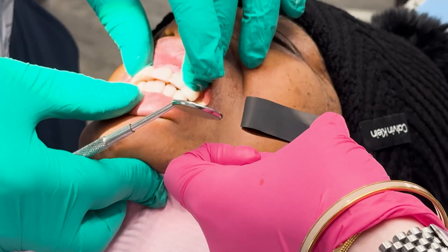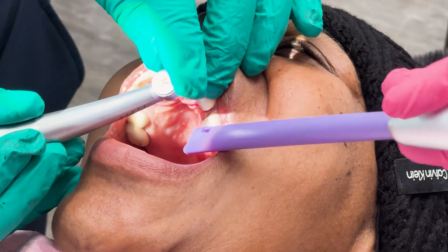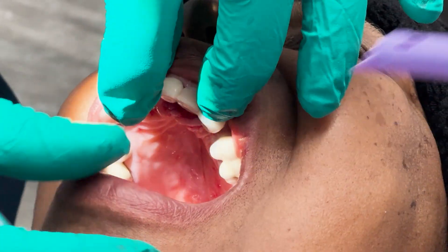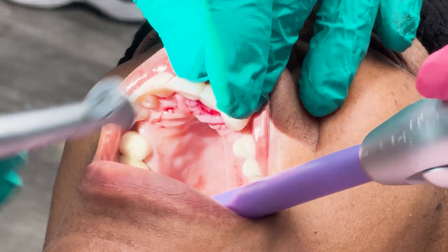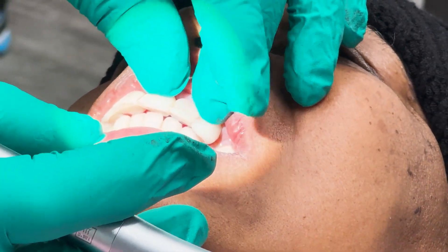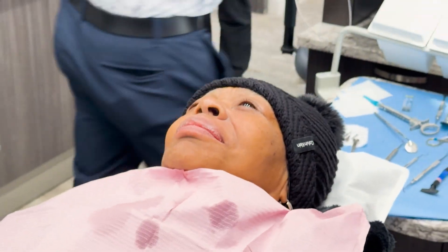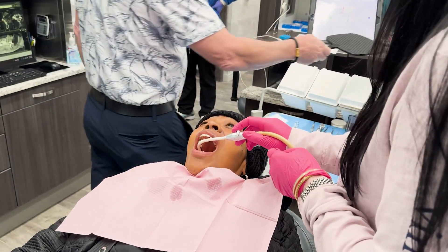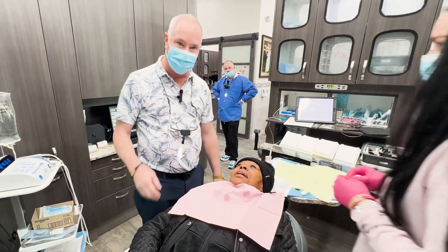Bite together — that's perfect. Let's see, bite again — one little spot is touching, let me just adjust that. Open for me. Bite together, open. Bite again — okay, perfect. Feel good Marie? All right, wonderful, you're all set. You want to see your tooth? Just temporary, okay? We'll let that heal for about four weeks and then we'll take your impression and make your permanent porcelain crown.